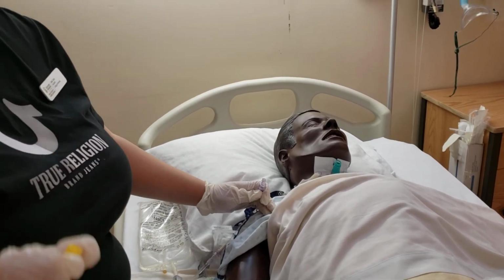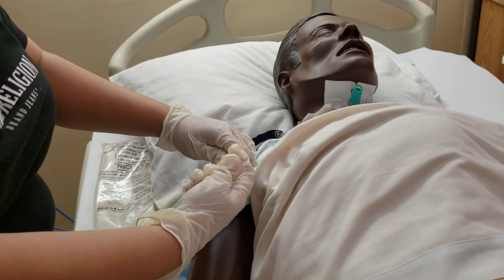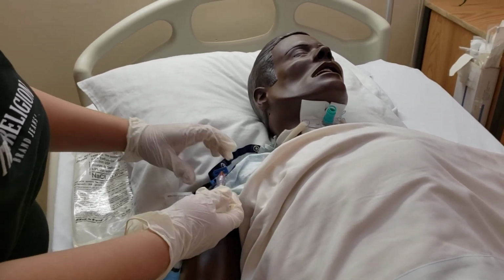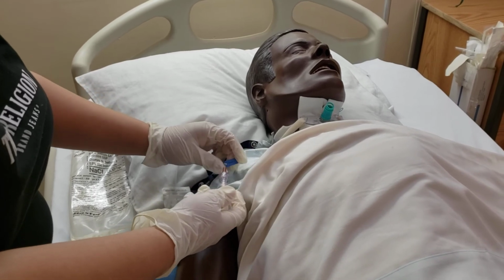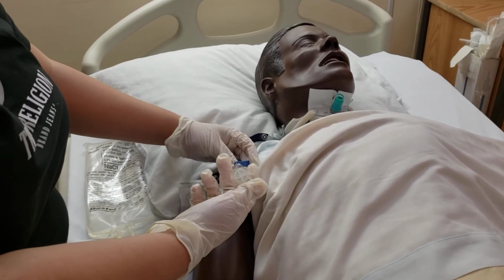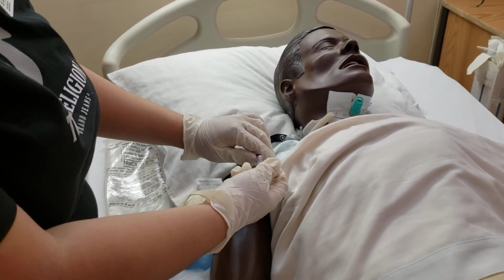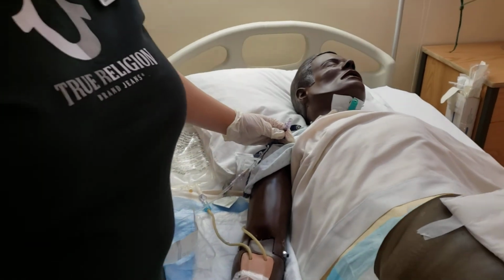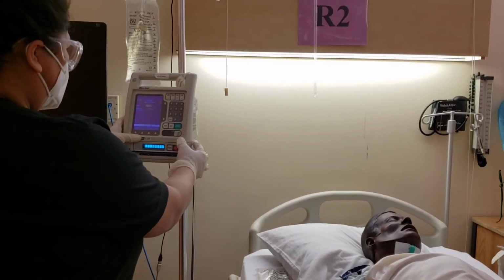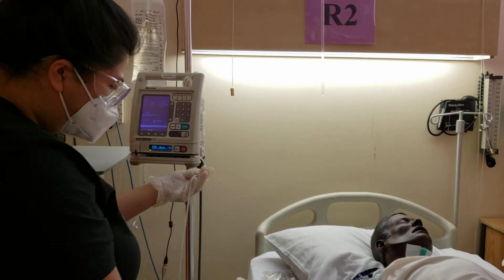And then for locking, we will use our heparin. We would instill the 1.5 cc normally, and then for the last 0.5 cc, we would create a positive pressure in the central line by clamping the line and instilling the last 0.5 cc of heparin at the same time. That's good. So we will remove this, and then we will restart our infusion. So primary, start, confirm primary, start, make sure that the clamp is unlocked.